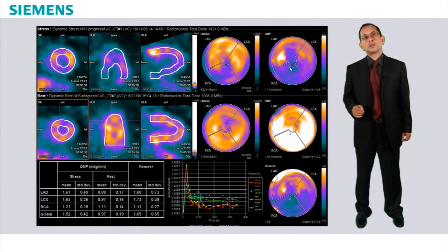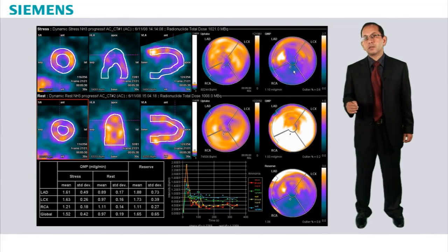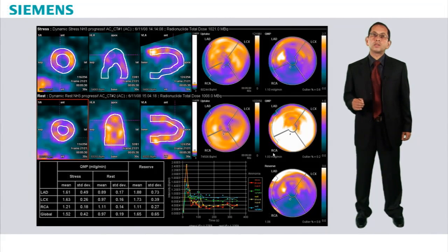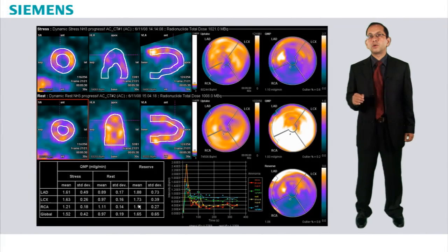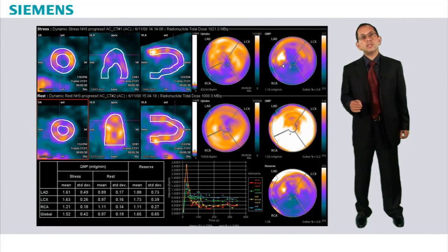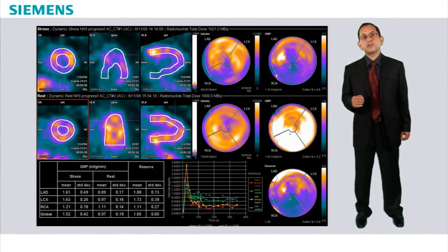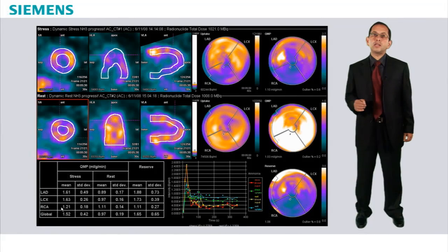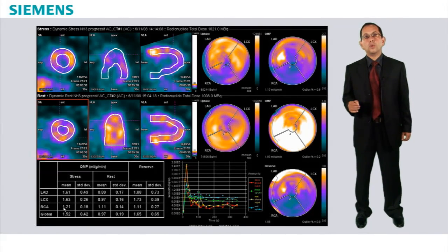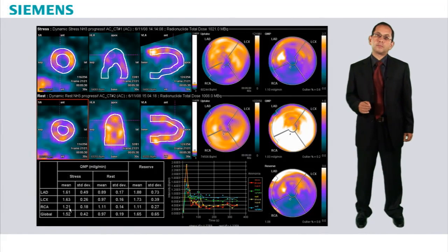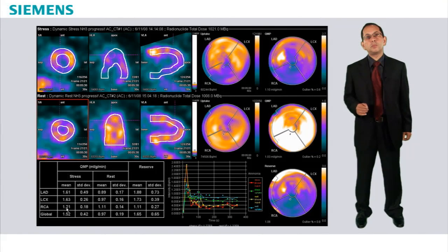In the stress flow polar plot we can click at any point to select a region of interest and look at the stress and rest flow values of that region, as well as the coronary flow reserve. We can also see the average flow of a particular arterial territory. For example, the right coronary artery territory shows pretty low mean flow of 1.21 ml per gram per minute. The lower limit of normal for peak stress flow is usually 2 ml per gram per minute, meaning there is significant ischemia in the right coronary artery territory.